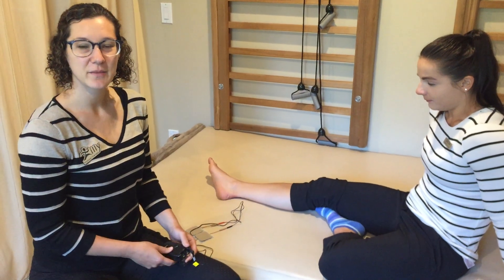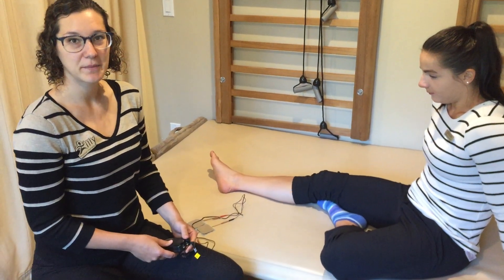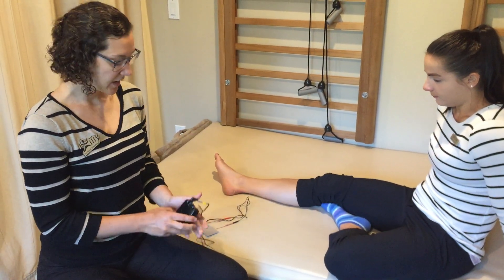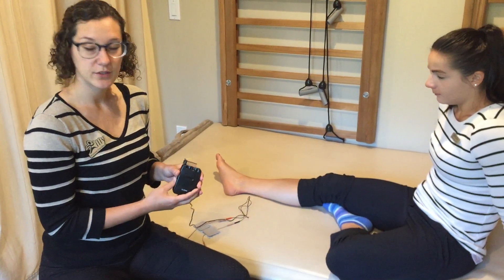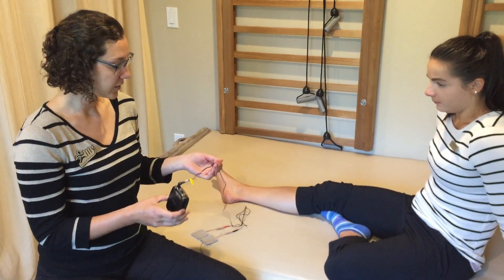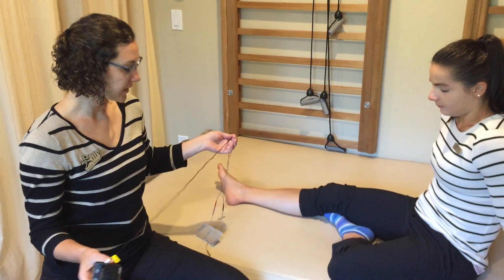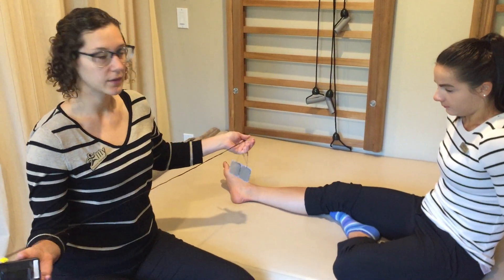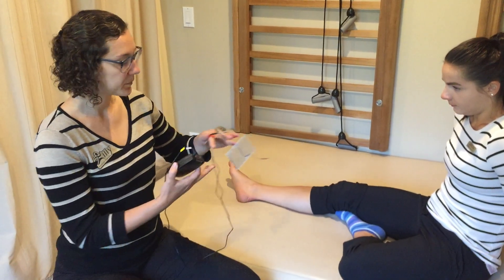Hey guys, Katherine here from Lilly Physical Therapy. Today I'll show you how to use a TENS unit to control urgency and incontinence with your bladder.